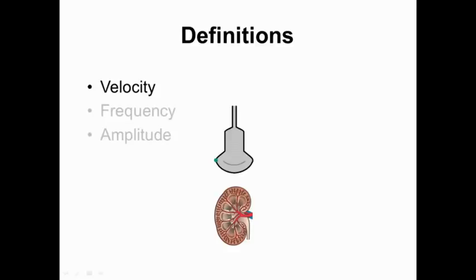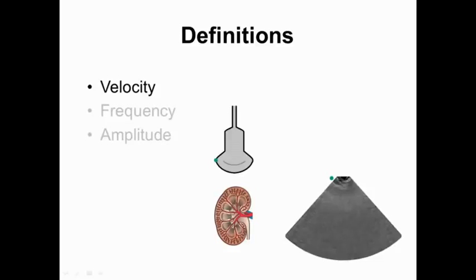For example, let's say we're going to ultrasound this kidney. This is what our screen might look like before any waves hit the tissue. To help orientation with the image on screen, you can imagine the probe sitting on top of the screen pointing downward into the tissues, as this is how they will be relayed. The first waves to return to the probe will be those reflected off the top of the kidney, as they have the shortest distance to travel and we assume all waves have the same speed. The faster the waves return, the closer the ultrasound machine interprets the reflecting tissues to be.